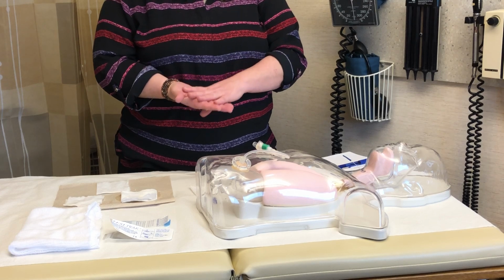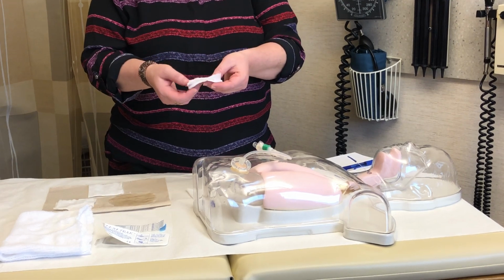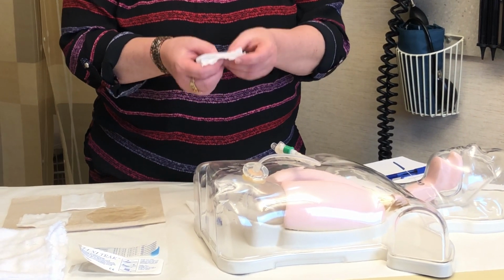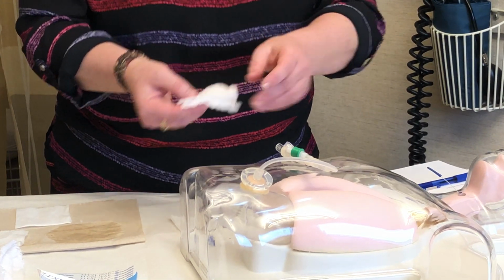First thing to do is wash your hands, either with soap and water. If you happen to have hand sanitizer at home, that's fine too. Clean your hands first, then get your soapy water. I happen to have soap in between two wet gauze here. Any soap that you normally use to shower with is fine to clean your site with. You do not have to buy anything special.